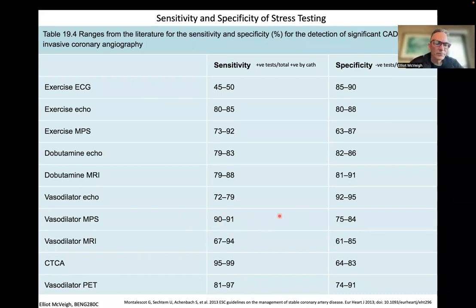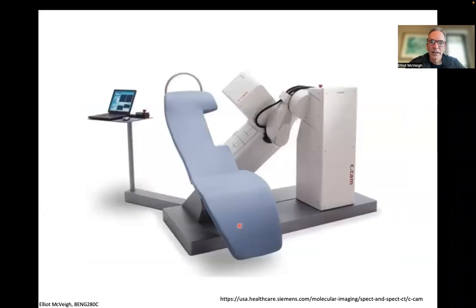So in the real world, when you look at myocardial perfusion imaging, I can't imagine it's actually 90%. My experience tells me it's like 70%. We miss a lot of people. Okay, and then we'll go into PET briefly later, but I'm gonna stop now.